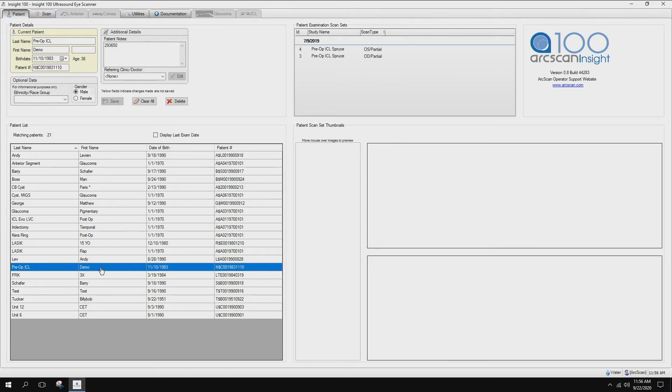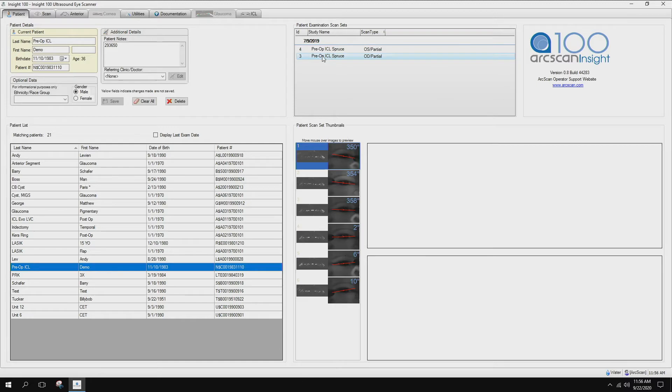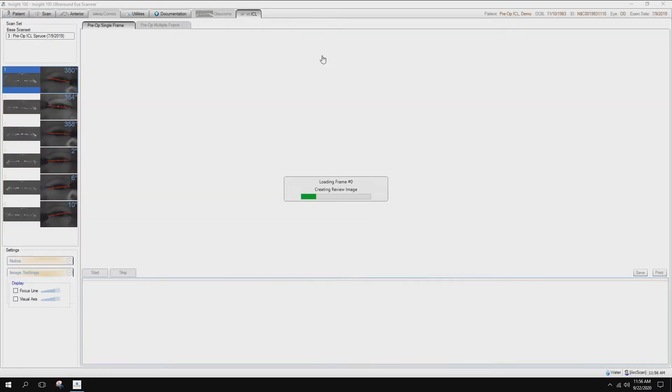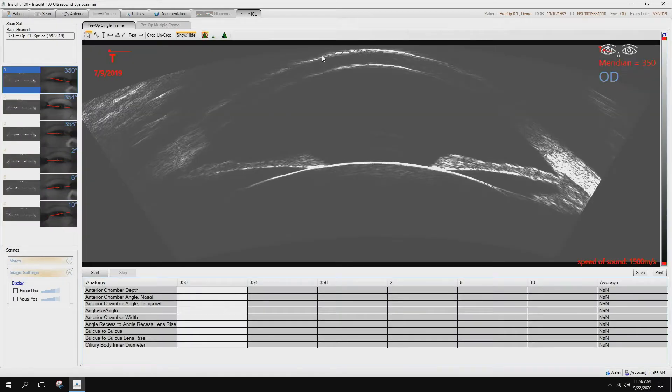You would select your patient name, come up here, double click on one of the scans, right or left eye, whichever you'd wish to go first.